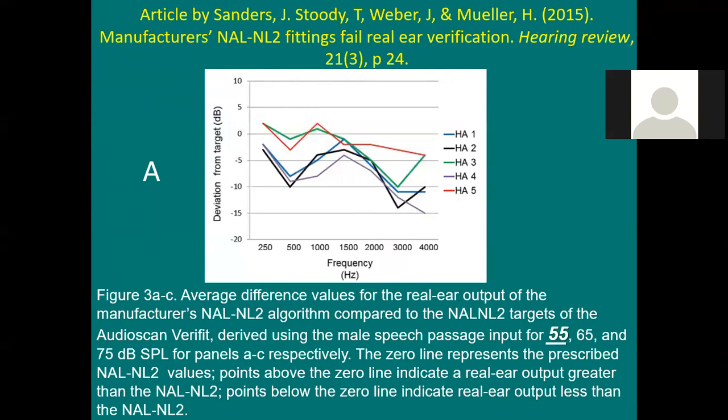So it's an interesting thing. But again, let's save our disgust against the manufacturers for doing this. I would just leave it neutral and just kind of tip my hat and say thank you for giving us your software so that we can get ourselves into the ballpark. Appreciate it, because I couldn't fit your hearing aid without your software. But I'm not asking you, Mr. or Mrs. Manufacturer, to do my fittings.